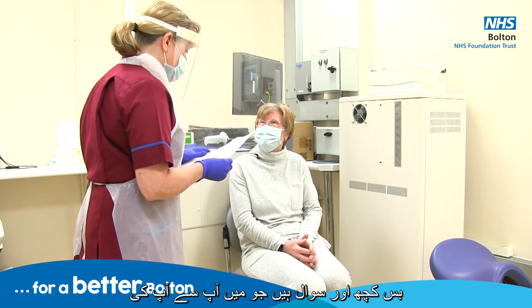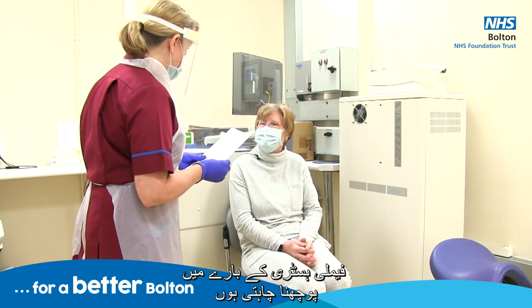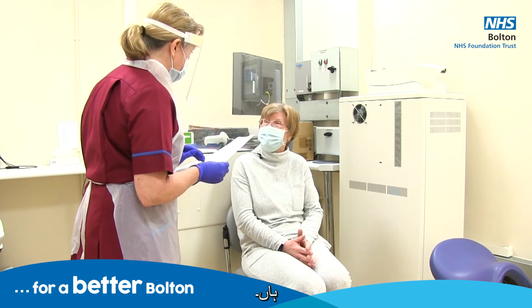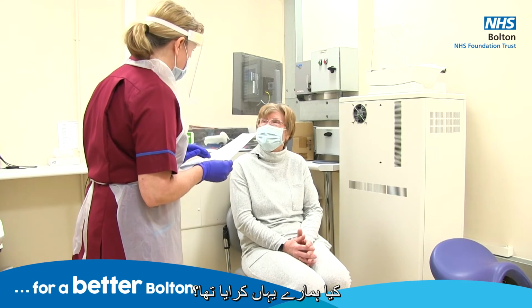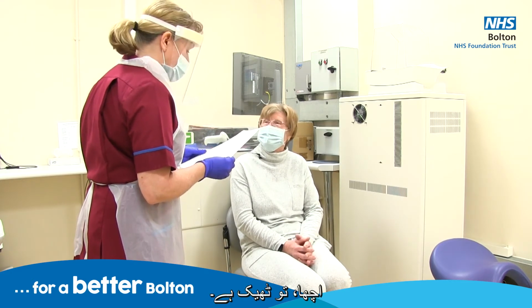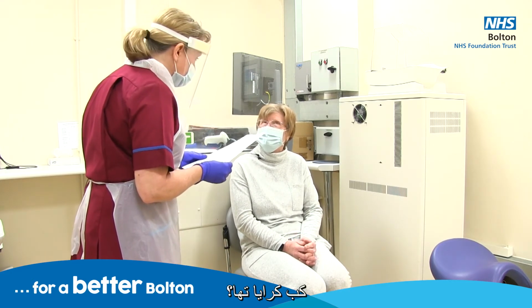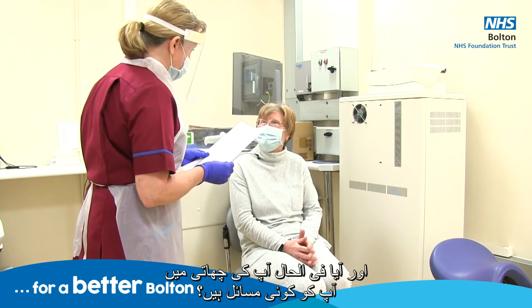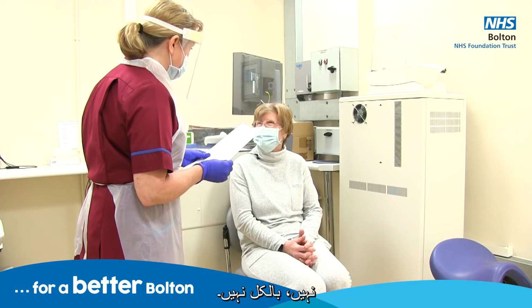Thank you. There's just a few other questions I just need to ask you about your family history, whether you're on HRT. Have you had a mammogram before? Yeah. And was that with us? Yeah. And when was that? 3 years ago. Lovely, thank you. And have you got any problems at the moment with your breasts? No, none at all.